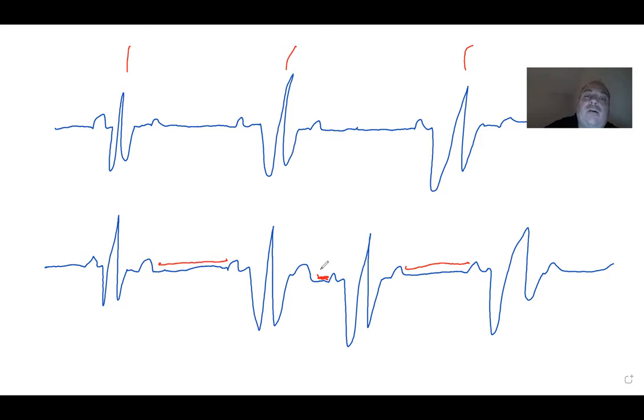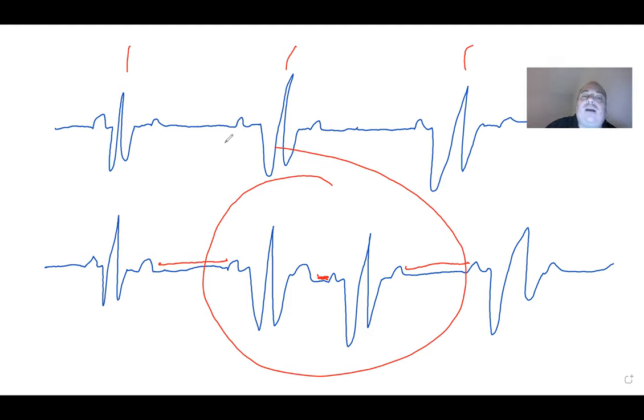cycle, if we were to draw out a whole bunch of cardiac cycles for a long strip, you would see that basically everything was probably normal, except in this one instance right here, we had a moment of irregularity because the P wave fired too quickly. It didn't wait long enough after the T wave. And then consequently, a QRS followed it. So it created a heartbeat a little bit sooner than it should have in the whole timing pattern. So that's the concept behind all of this.